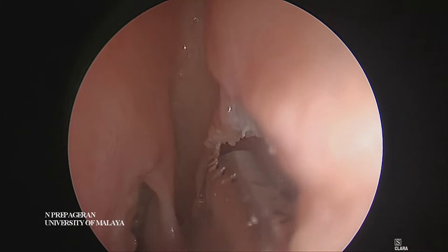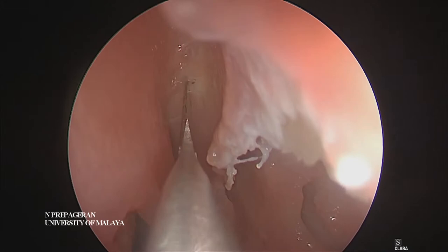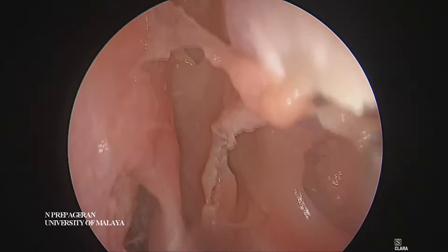Once you've got this, you can see the middle turbinate joining on both sides. Then what we need to do is to cut here and down here this way — using the elevator or sickle knife.